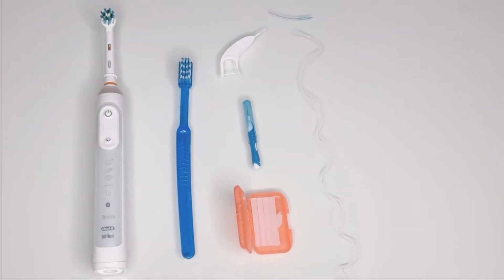Congratulations on your new braces! It is important to have great oral hygiene, which will keep your teeth and gums healthy and help speed up your treatment. Here are some of the tools you'll find in your braces care kit.